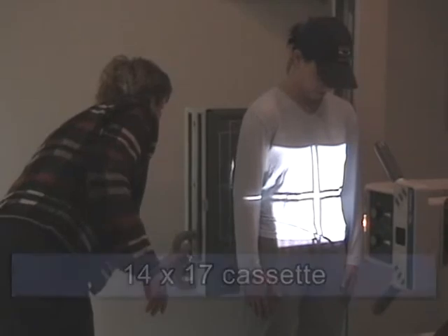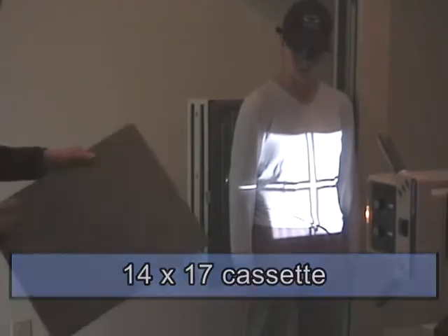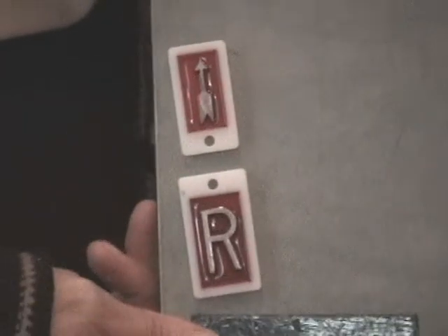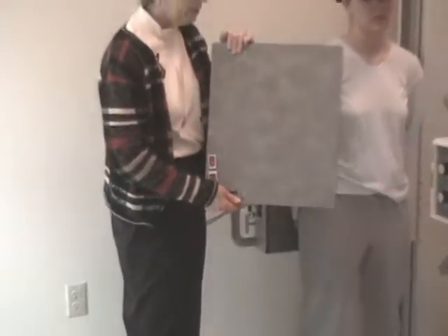I'm going to utilize a 14 by 17 ID blocker to the bottom, so they can see that we're going to use an R marker for the patient's right side, and we're using an arrow, an upright arrow. Your department might have a marker that actually says the word upright or says the word perhaps erect. But you need to mark on this film with lead that this is the patient's right side, or you could use a left over here, but you must have an arrow or some indication that this is your upright position.